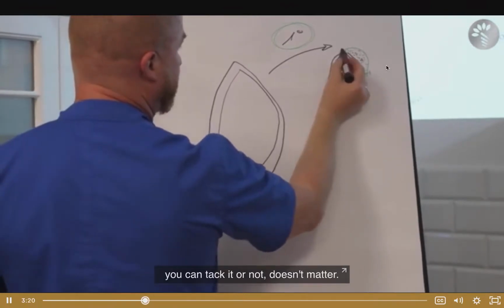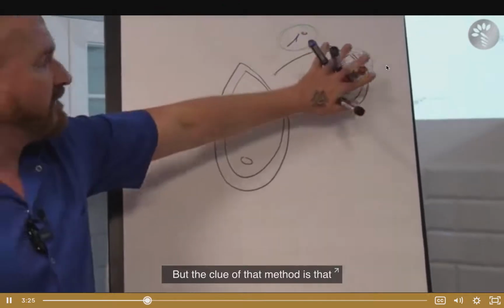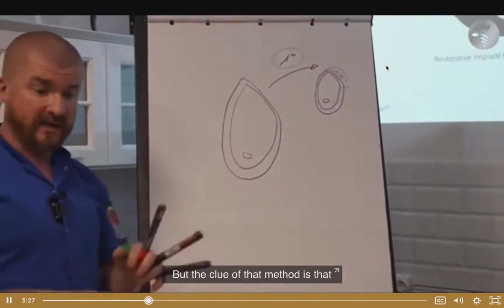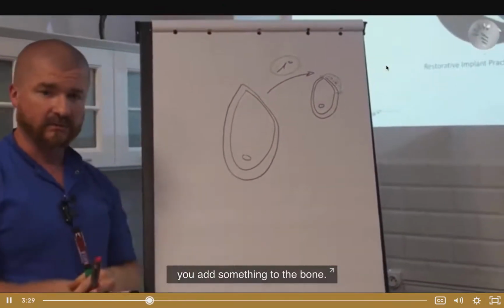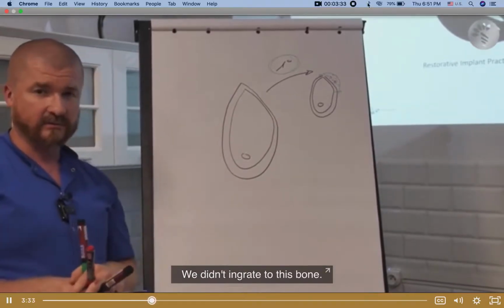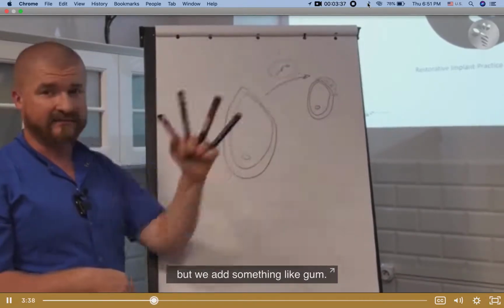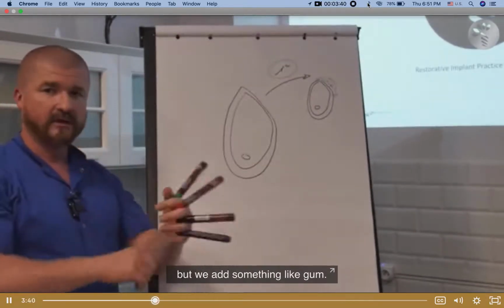You can tack it or not. Doesn't matter. But the clue of that method is that you added something to the bone. We didn't integrate into this bone. We didn't change the shape of this bone, but we added something, like gum.